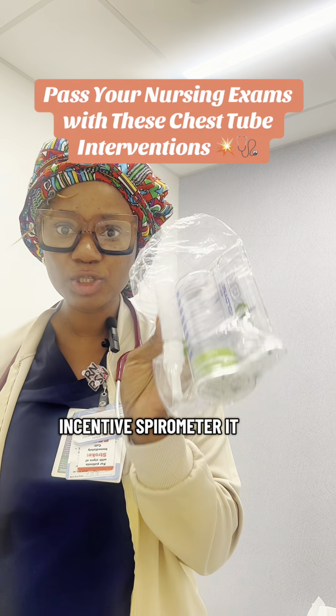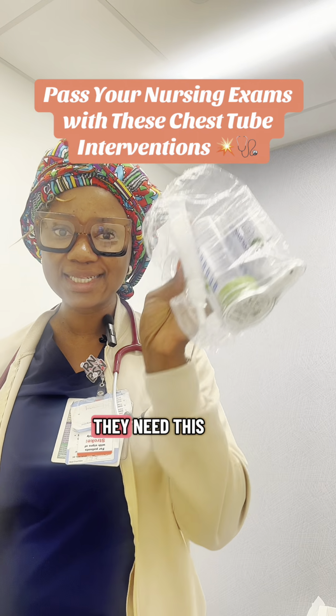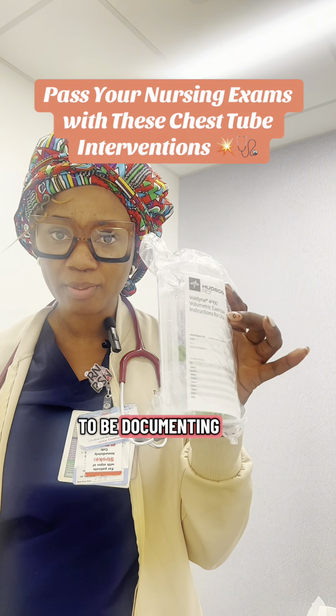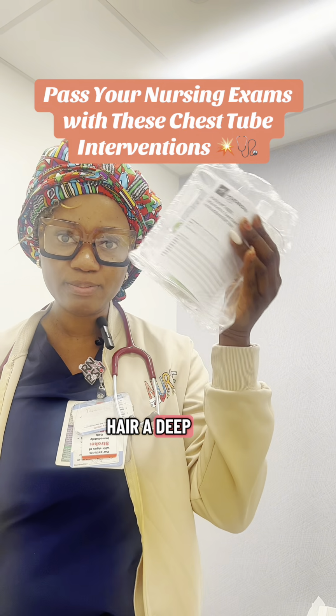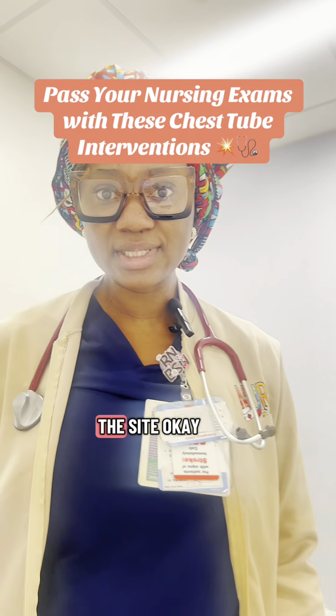This is the incentive spirometer, and it helps with breathing and expanding the lungs. They need this. They have to be using this. There's an order for this, and you have to be documenting how much your patient is able to blow in it and take deep breaths. Okay. Very important. You also want to assess the site, okay?